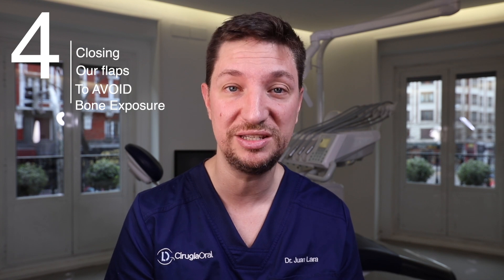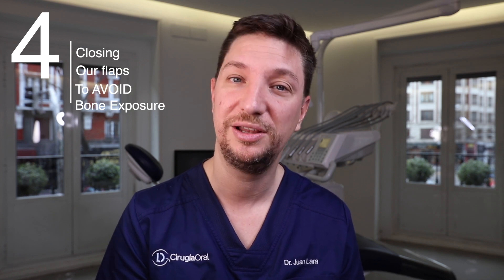Hello guys, today we are going to see four ways of closing our flaps to avoid bone dehiscence and bone graft exposure. Let's go for it.